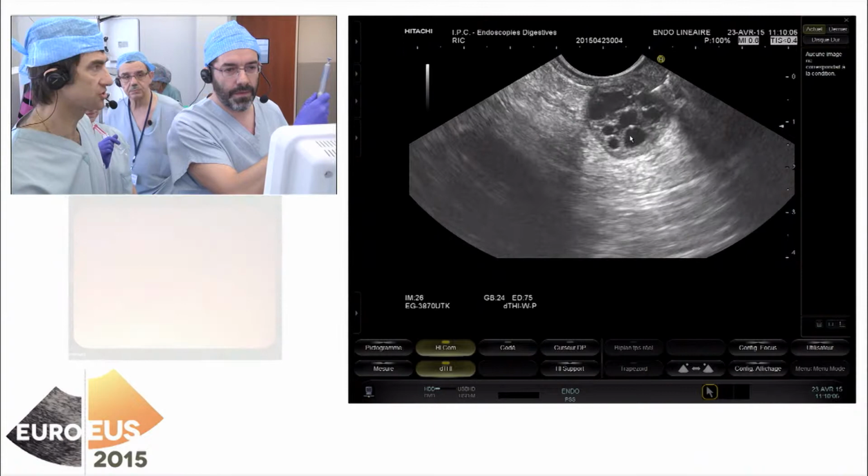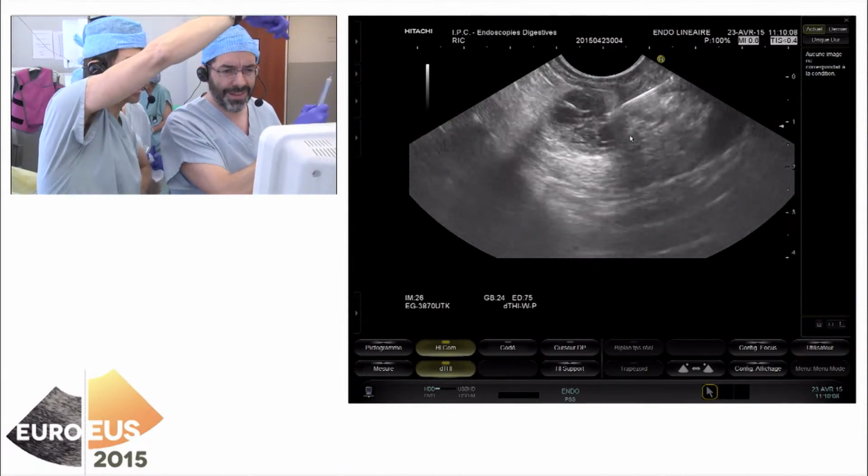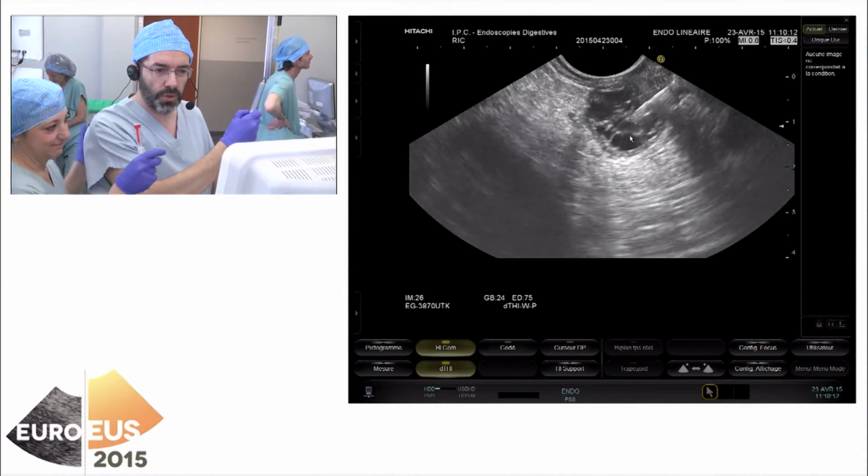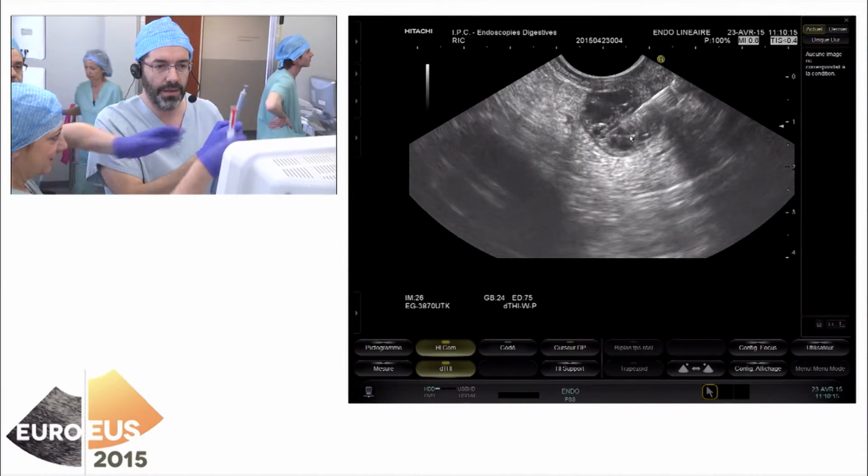So as you see, he has retro, and now you are in. We're inside. Yes. So we perfect. We will try to go to the enlarged wall.